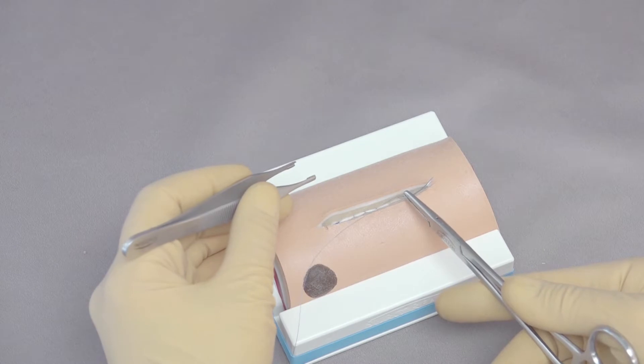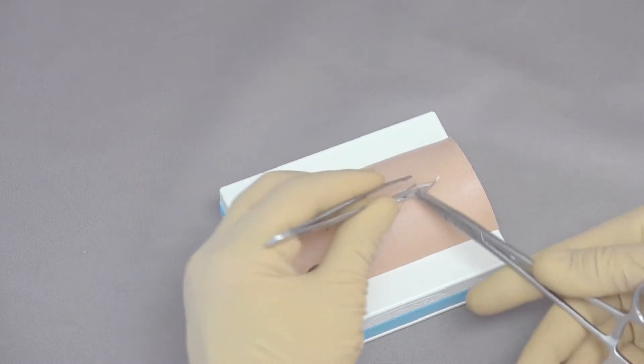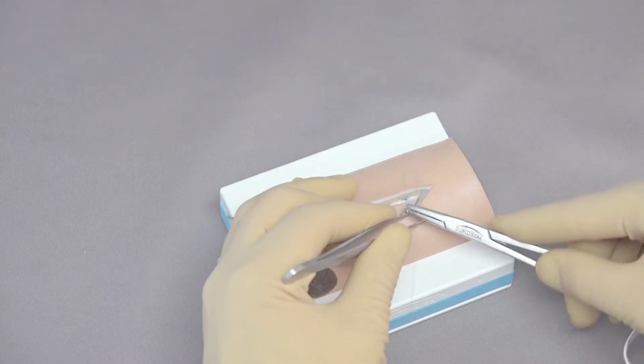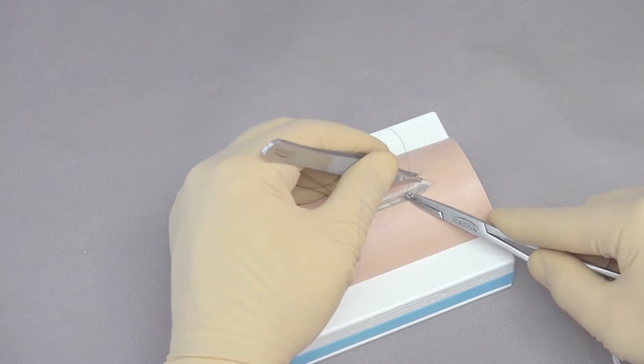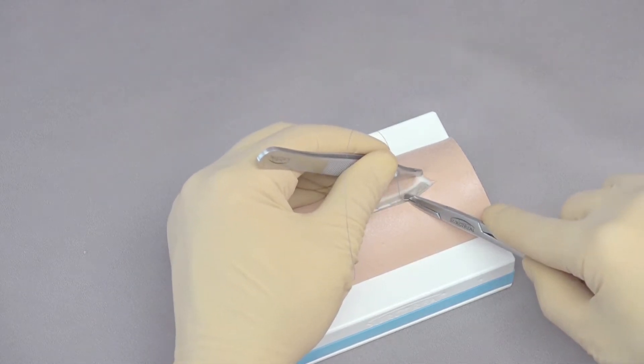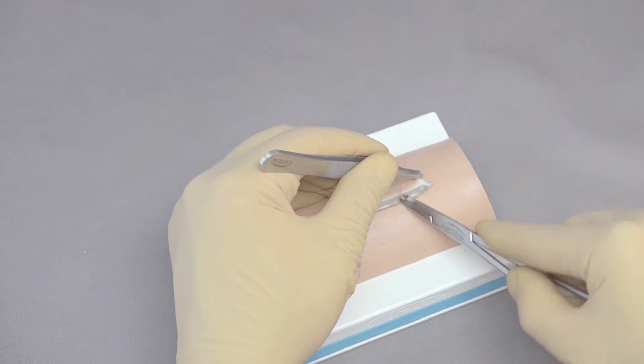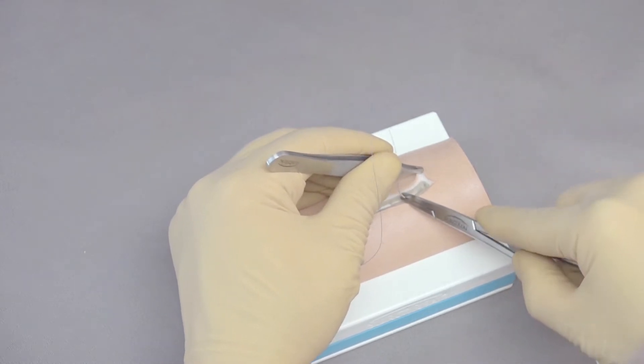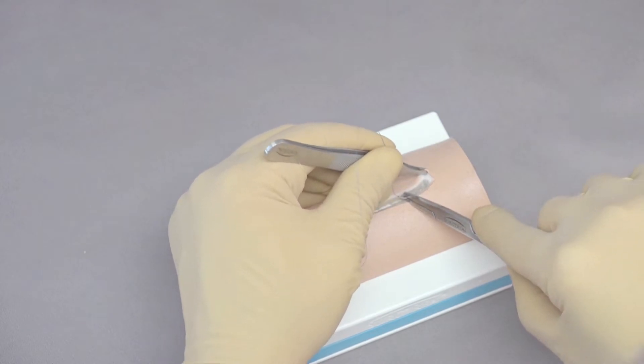We're going to start with the needle going backwards at the depth of the incision so the knot stays buried. So we go into sub-Q tissue and then we want to pull the epidermal layer back and have our needle come out just in the dermis itself, and that can be fairly challenging to get started. The thinner the epidermis or the dermis, the more challenging. So there we go.